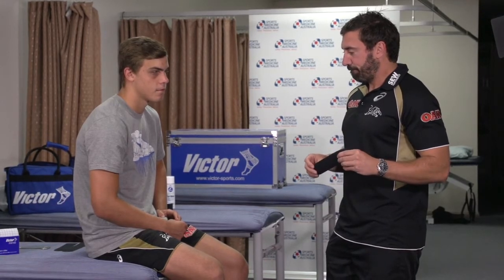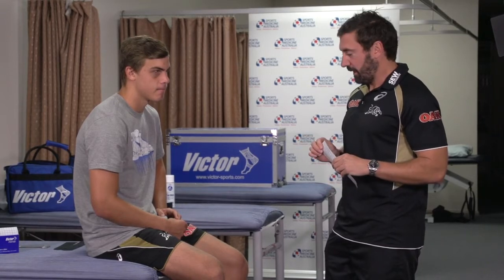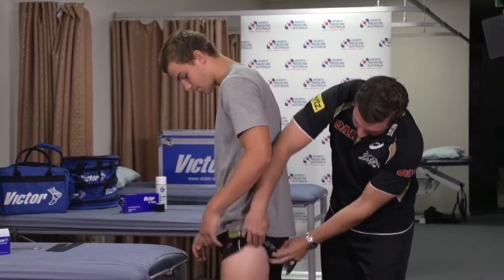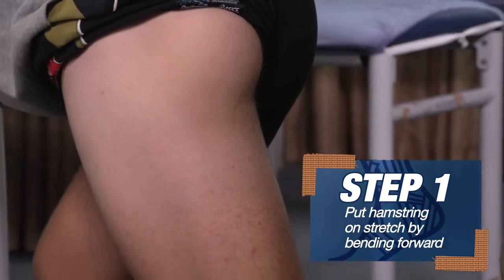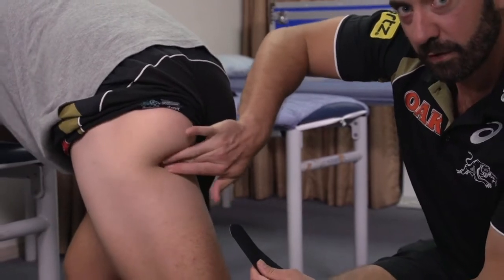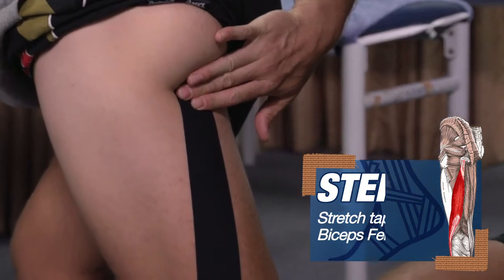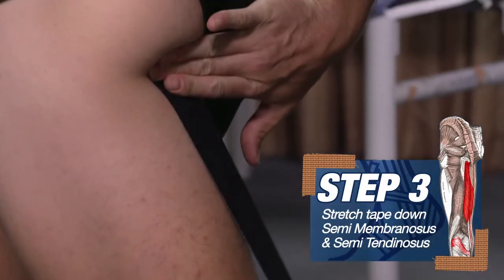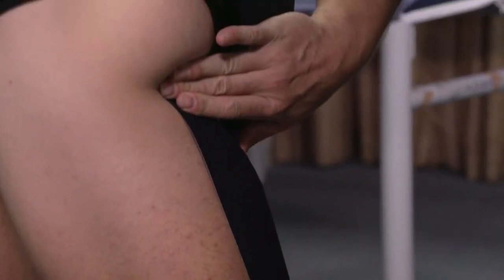Okay. First of all, we're going to go through the position in a lengthened muscle, and I'm going to get Jack to stand up. So with his left hamstring, expose the area and put his hamstring on stretch by bending forward. So obviously going to start up on the hamstring origin, or the insertion onto the ischial tuberosity. Okay, just above that, and stretch down laterally following the biceps femoris. Then we'll do a second one again, ischial tuberosity immediately following the semimembranosus, semitendinosus tendons immediately onto the knee.